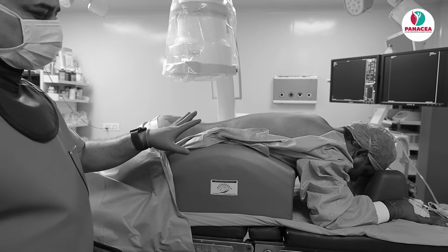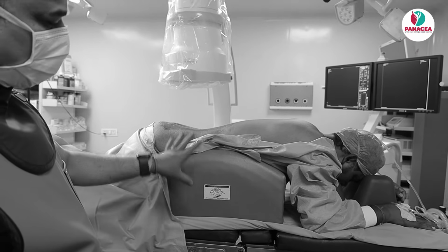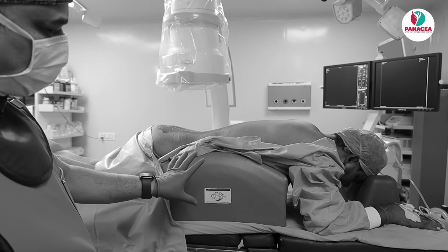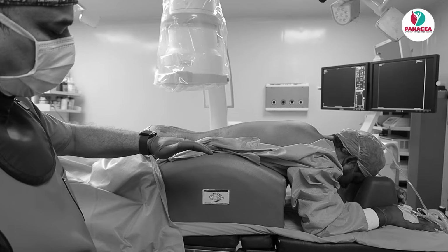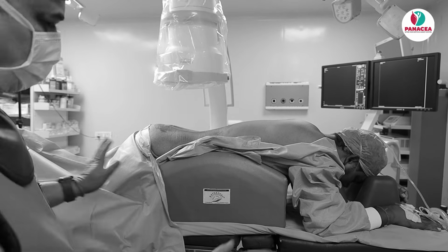If you look at the position of the patient, see there is a small soft pillow under the abdomen. It almost looks like a Wilson frame. The purpose of this pillow is to kyphose the lumbar spine. Usually any lumbar spine has got some amount of lordosis. We want to obliterate or kyphose the lumbar spine by putting a pillow under the abdomen. So this is the position.